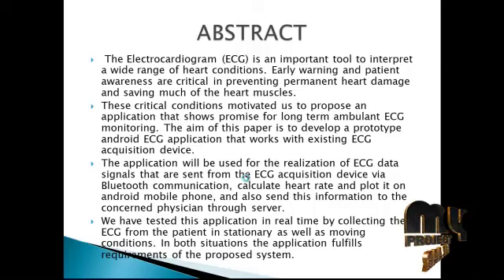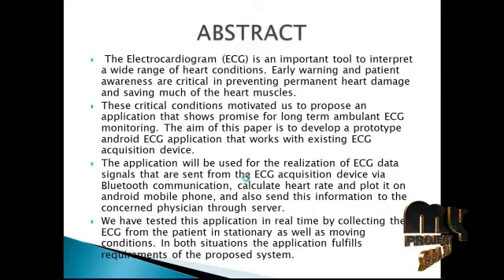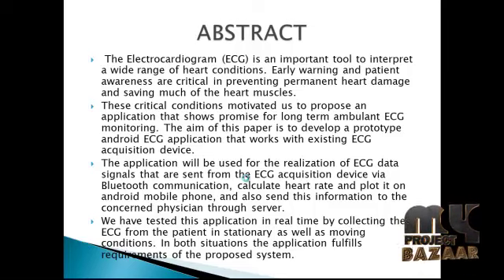Although it is possible to alter the output of most ECG devices, it is standard to represent each millivolt on the y-axis as 1 cm, and 25 mm on the x-axis per second. We can also use faster paper speeds, for example, to resolve the finer data of the ECG. One small block of the ECG paper translates to 40 ms.